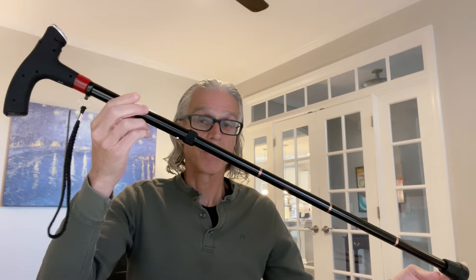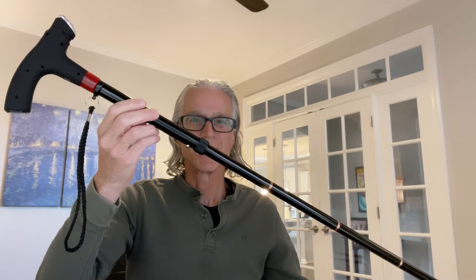Just one quick correction here — I misspoke. This cane at the top end is 36 inches, and at the bottom end is 32 inches. So that's suitable for people from approximately five foot four to six foot. I'm six foot two, so this cane is actually not tall enough for me. I really think a cane in the U.S. needs to go up to more like 38 inches — 36 is just not tall enough. Too many people over six feet tall need canes.